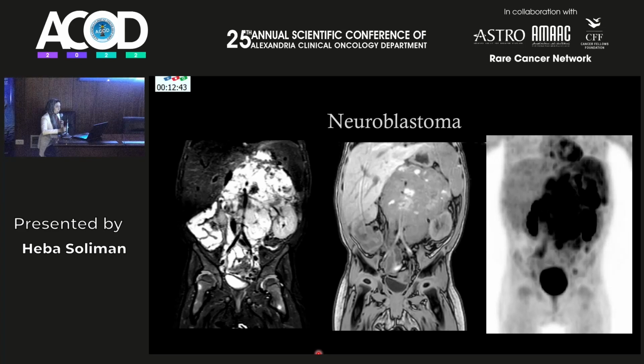So at first, they treated this patient as low risk. Whole body MRI was performed just after the PET-CT, delineating the bone marrow infiltrates, and it was upgraded to high-risk neuroblastoma. And afterwards, the bone marrow biopsy confirmed the bone marrow infiltration.